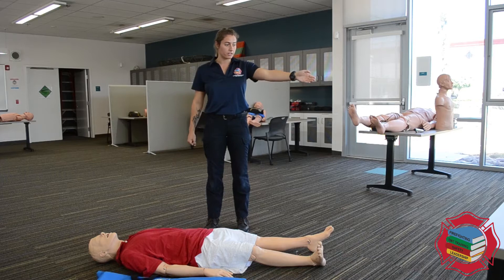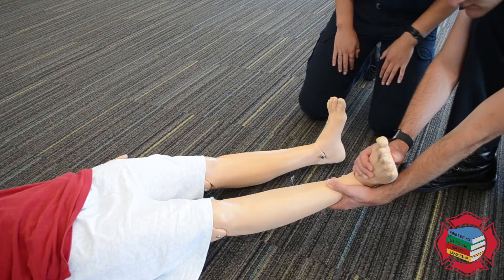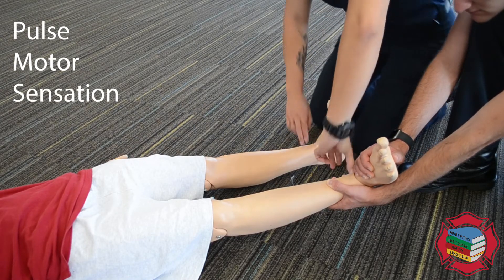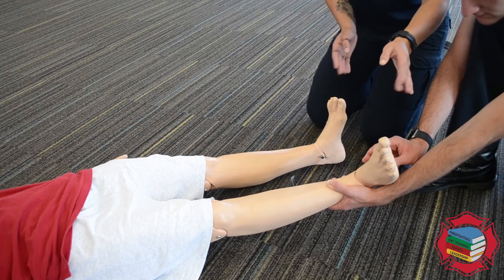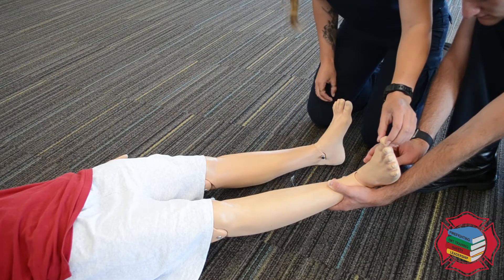I'm going to have my partner grab his right leg and pull traction for me. Once we have traction being held, we're going to check PMS and we're going to check it bilaterally. We're going to check the pulse first, and we're going to ask him: can you wiggle your toes, can you feel this, can you feel this, what toe am I touching, what toe am I touching.